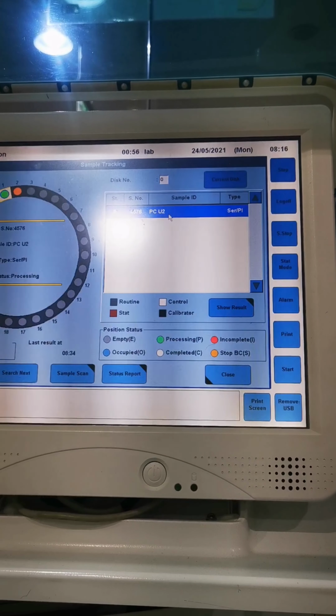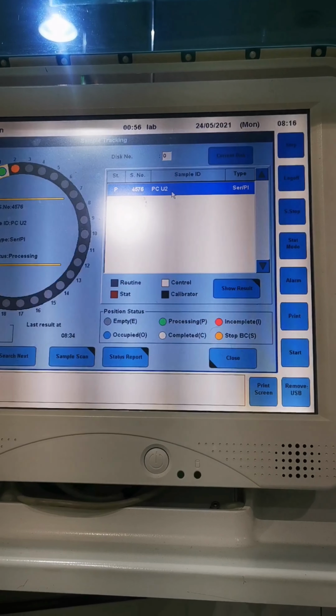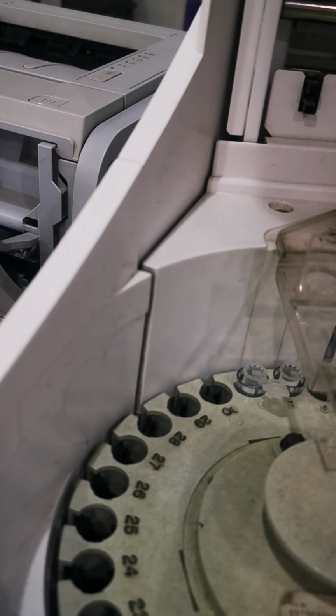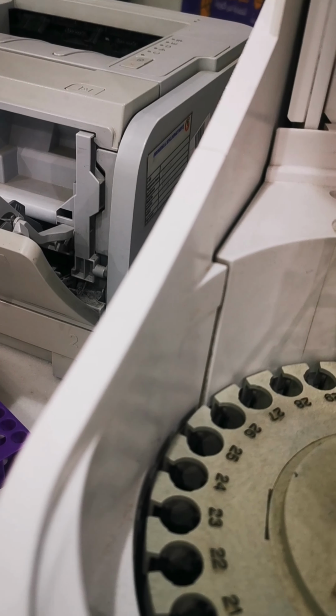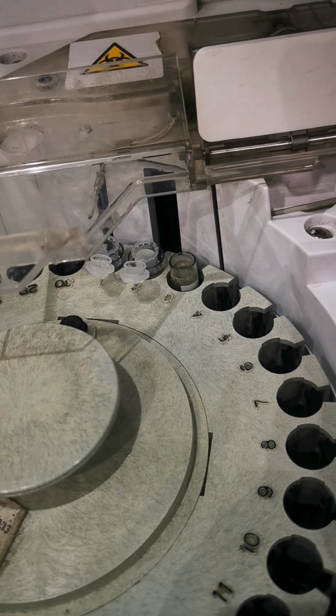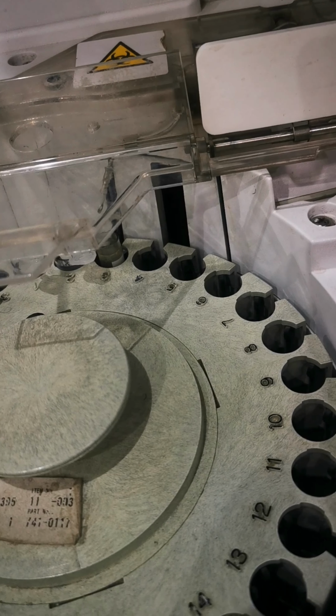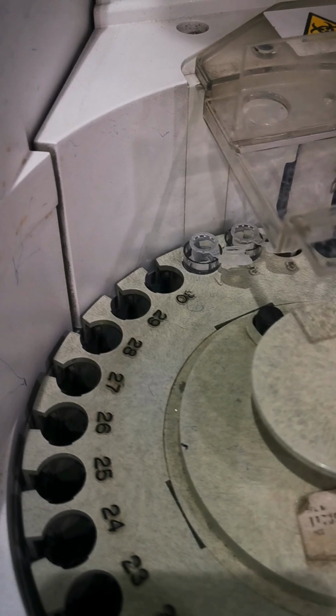So number 1 is for our PCU2. So the tests that we selected for our PCU2 are now in process. And now the machine is scanning our cuvette number 2. It will just scan, then process the sample, then after that it will give us the result.